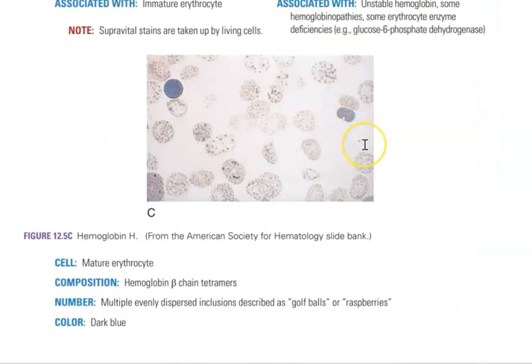Okay, down here in figure C, these are showing you hemoglobin H, and again this is stained with a supravital stain, new methylene blue. These are described to be like a raspberry or a golf ball.